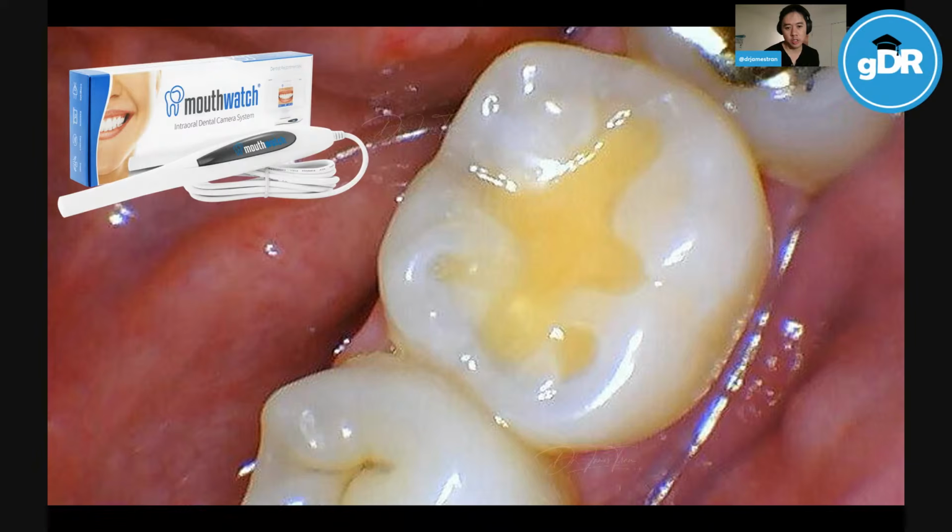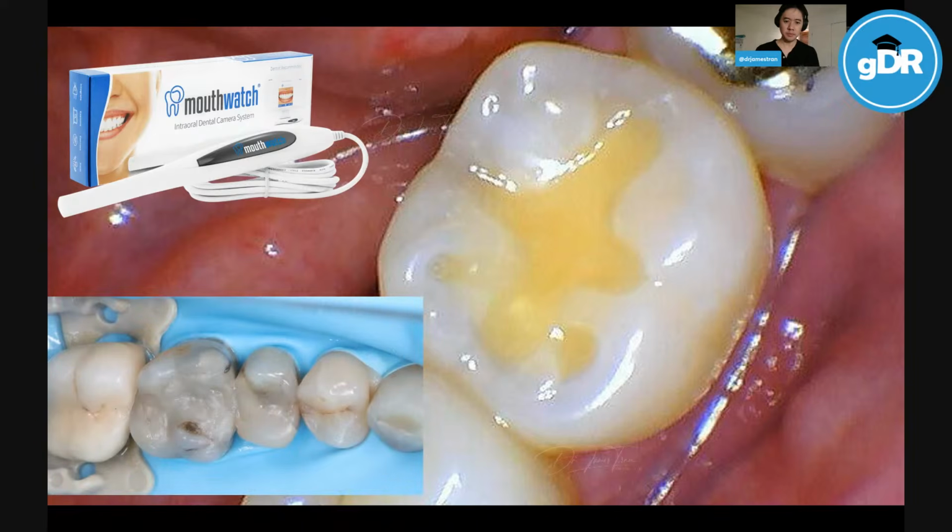This is an example of MouthWatch, considered one of the best intraoral dental cameras on the market. Yes, you can see the detail there. But does the patient really notice? Probably not. And you're limited by the view. You can only see one tooth here, maybe half of either tooth on either side. To take a full arch, you have to take multiple photos, bang, bang, bang, stitch them together, then explain to the patient, this is your back tooth, this is your second back tooth. It's too much explaining. If you just take one photo of the arch, it's so much easier to talk to the patient about things.